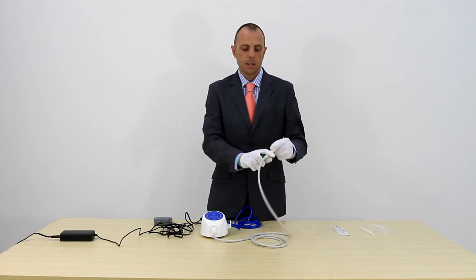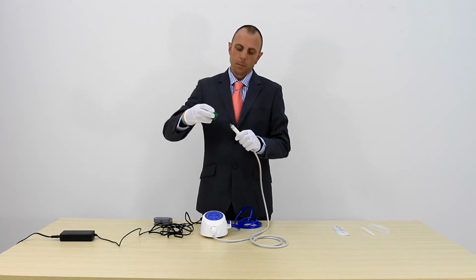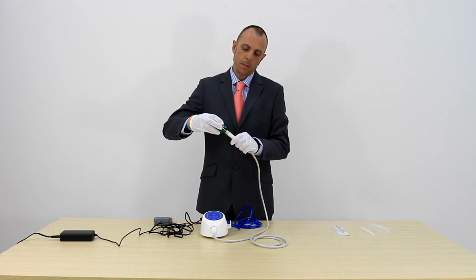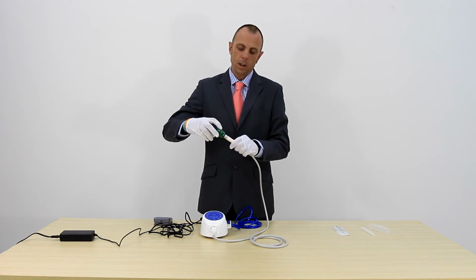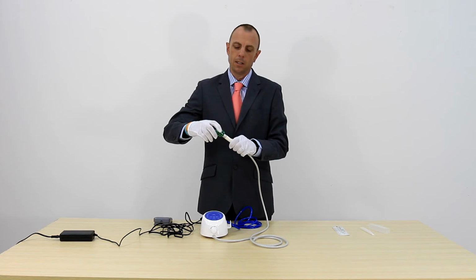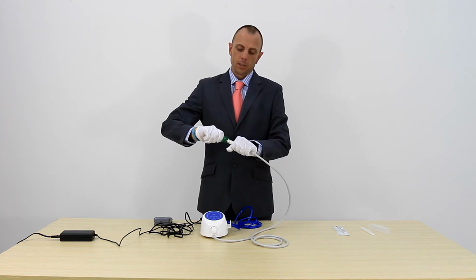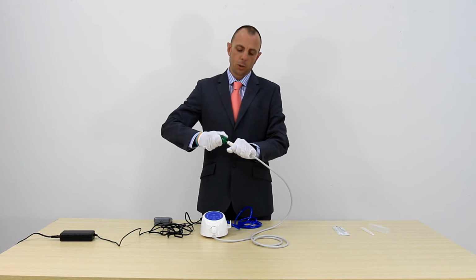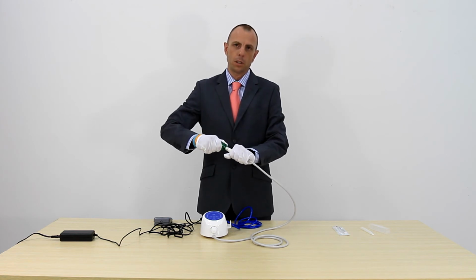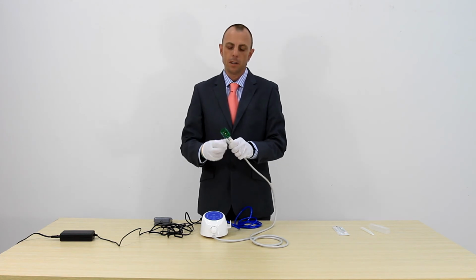Okay, so the tip's inserted, pick up the handpiece itself, place the torque wrench onto the top of the handpiece, and then turn slowly in a clockwise direction. You'll know when the tip has gone all the way to the bottom because it will suddenly get harder to turn. Okay, once it's all the way on, just keep turning and the torque wrench will set the correct torque for the tip onto the handpiece. It will not damage the handpiece itself.